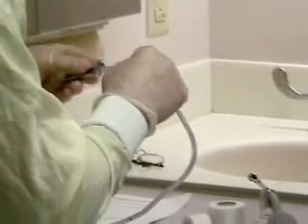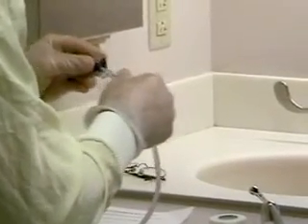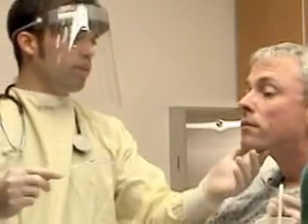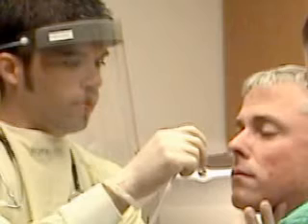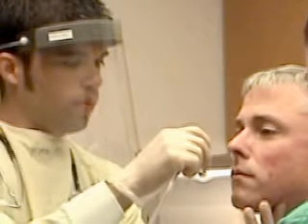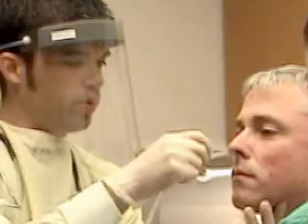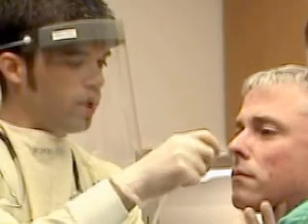Lubricate the distal tip of the nasogastric tube with surgical jelly or viscous lidocaine. Position the patient sitting upright in the sniffing position. Insert the tip of the nasogastric tube into the nasal cavity and slowly advance it posteriorly parallel to the floor of the nasal canal. The tube should not be directed upwards.